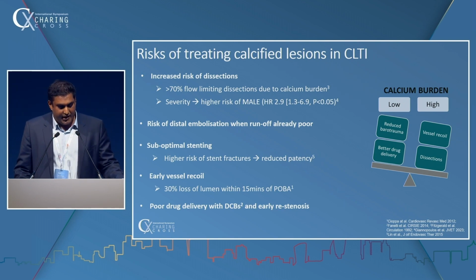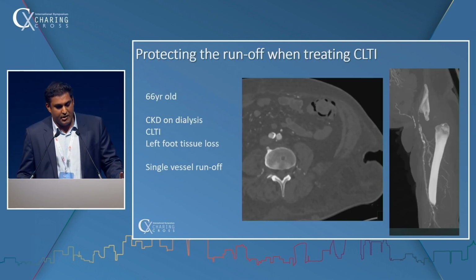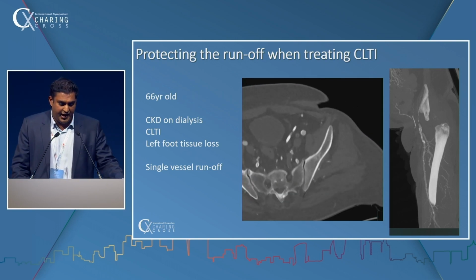And most importantly, the use of DCBs. In these patients where there is no access to the media, these DCBs don't have much effect. And we know we need to reduce restenosis in these patients. So I'll show you a few cases now.